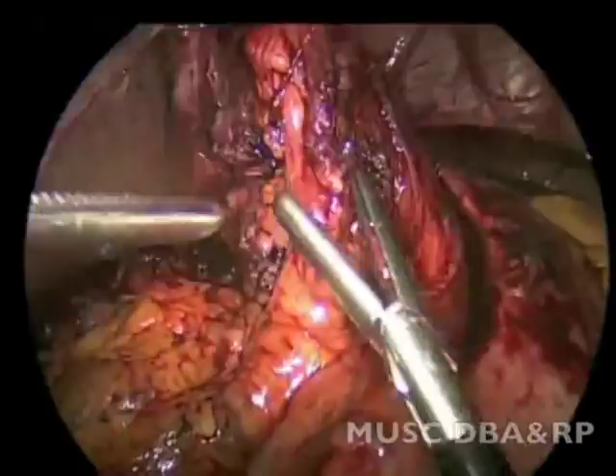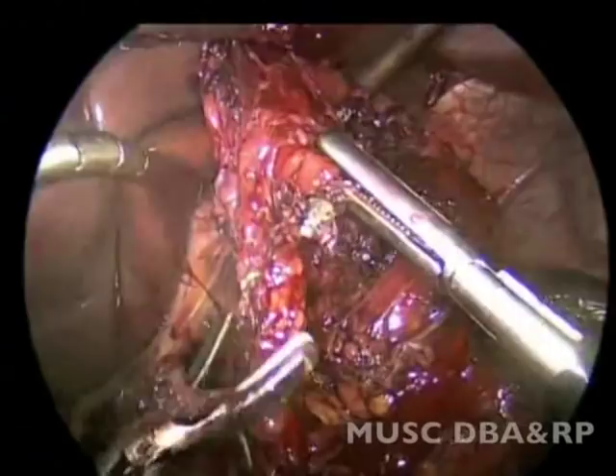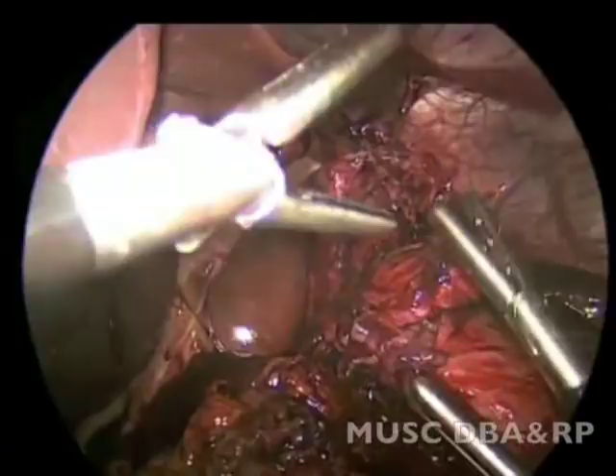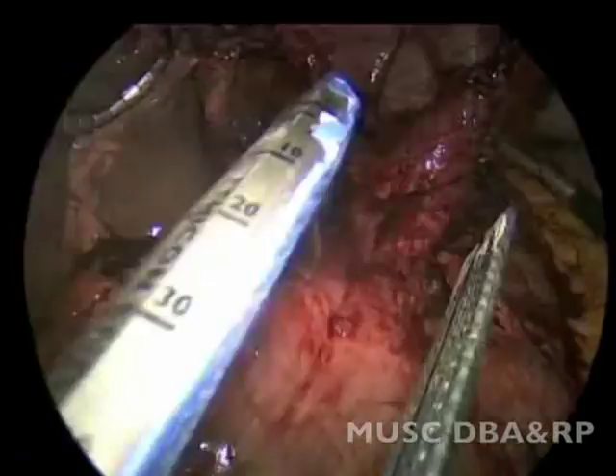Omental attachments to the remaining fundus are taken down in order to facilitate unwrapping the wrap. The devitalized portion of the fundus is then stapled off using a GIA stapler.